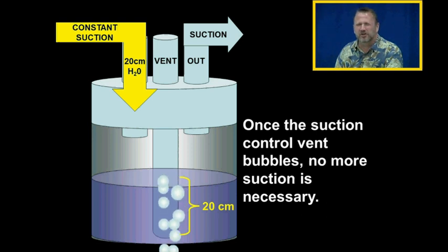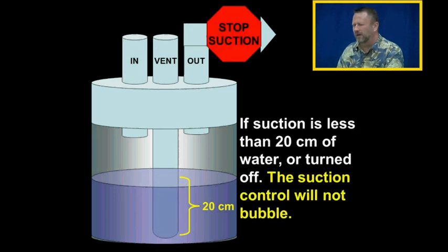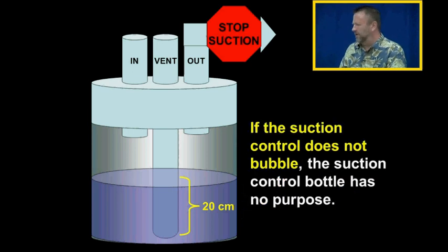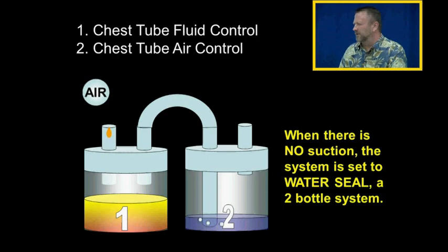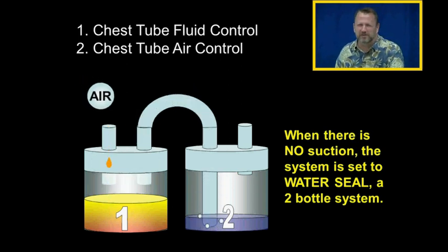So once that suction control vent bubbles, no more suction is necessary. If the suction is less than 20 centimeters of water, or the suction is turned off, the suction control will not bubble. Well, if the suction control does not bubble, the suction control bottle has no purpose. And if we're not applying suction to the system, then the system is automatically set to water seal, the two-bottle system.